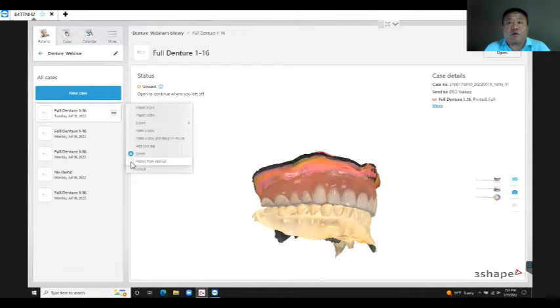They waited, I think it's like 45 days, for 3Shape to take out the scan stream. So it's better to protect from cleanup if you think you're going to be able to use the same scan. But for me, if it's a 2 week old scan, I'm going to scan the patient again as I see them again.